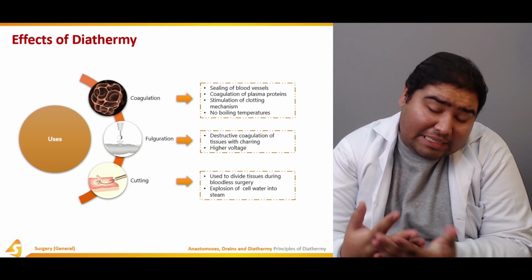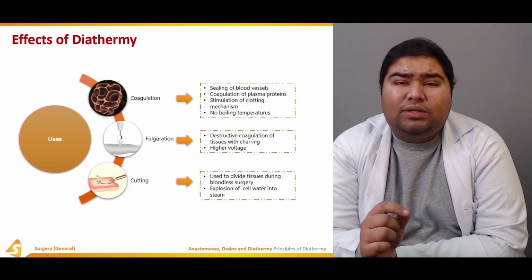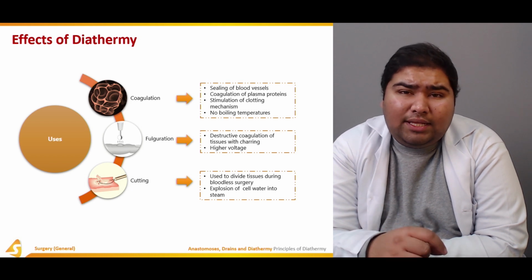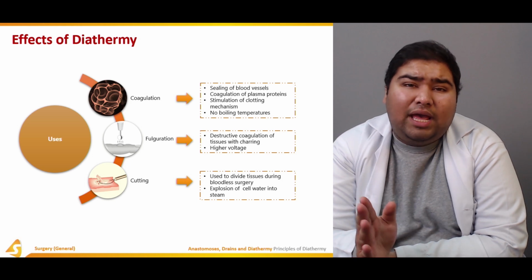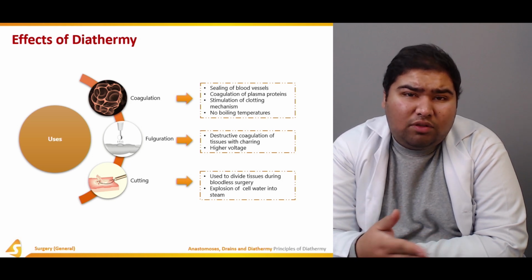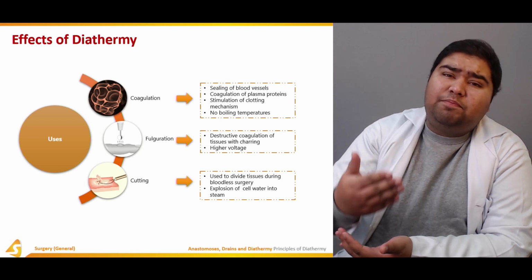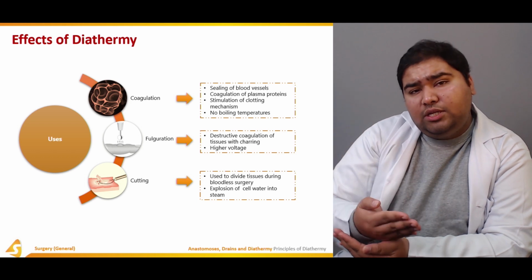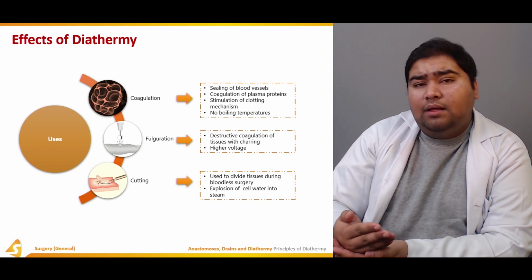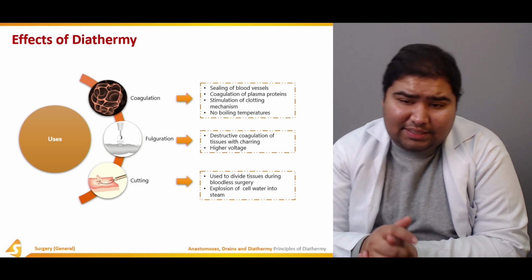So now, why is it bloodless surgery? Because you're being very careful. You're slightly coagulating any points, any bleeder points, so there's minimum blood loss, and you're going through the planes of the body. When passing through the bodily planes, it prevents extensive damage. So you're going through the bodily planes, preventing any bleeders from occurring. So this is a bloodless surgery.